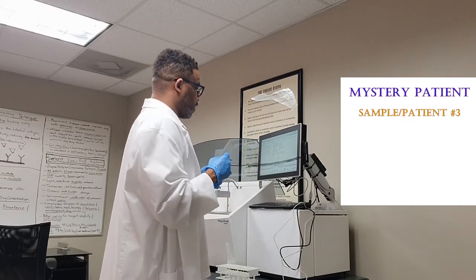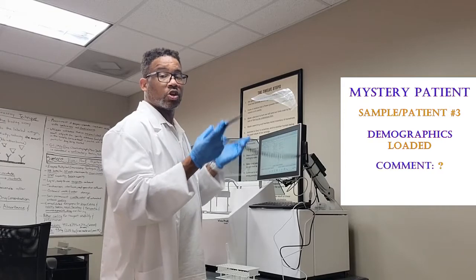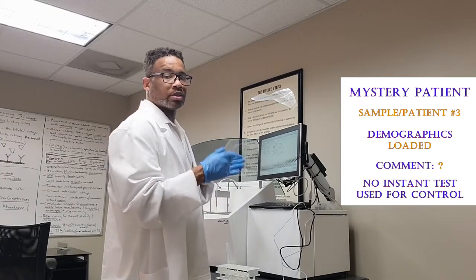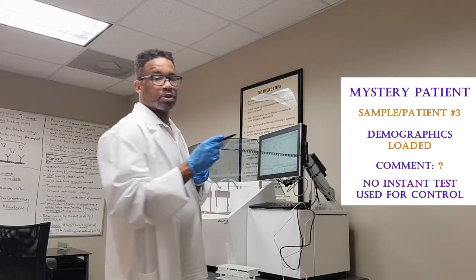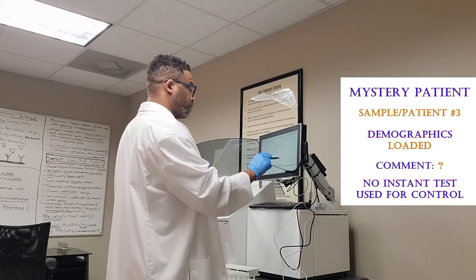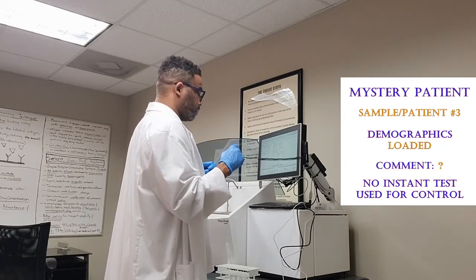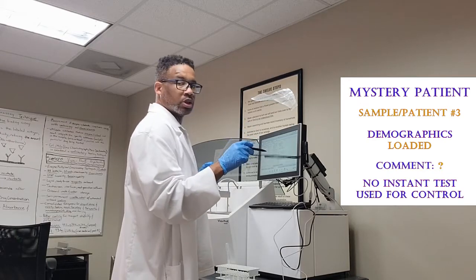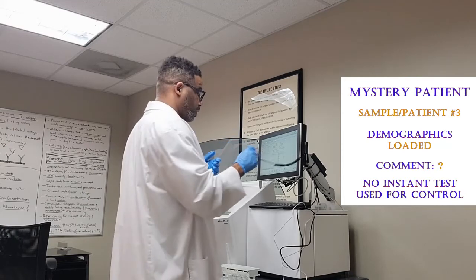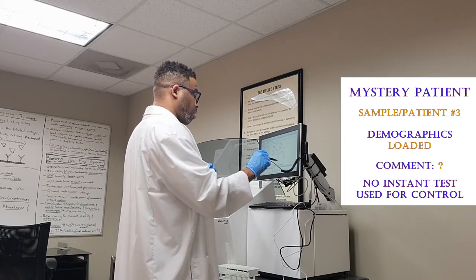All the demographics are there, and we had a question mark because we don't know what's in this. We're just going to find out. So we don't have a control. We're just testing to see what we find, and if it comes into our system, it comes into this experiment valid. So for opiates, we are negative. Cocaine is negative. MD, which is our multi-drug, is negative. THC is positive, which a lot of these samples are positive in some regard for THC.